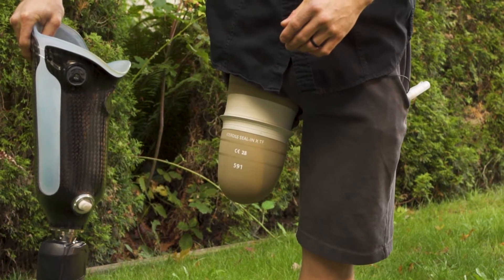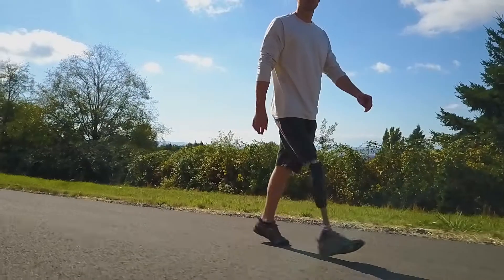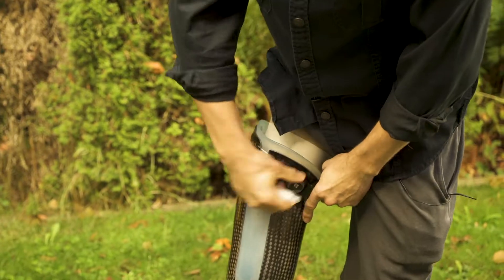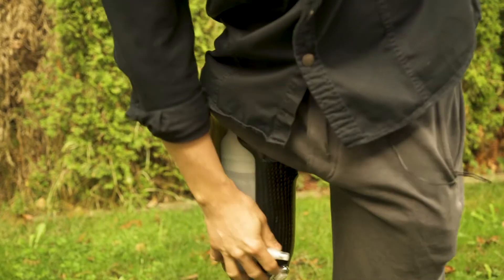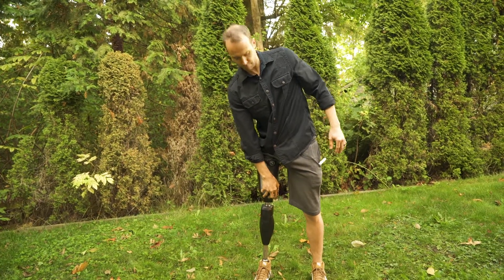I've been an amputee for about nine years. I was in the hospital for seven days — I couldn't wait to get back on my feet again. So when I met with Cornerstone, I got fitted with the hi-fi socket. It allows me to be extremely active and do all the things that I used to do.